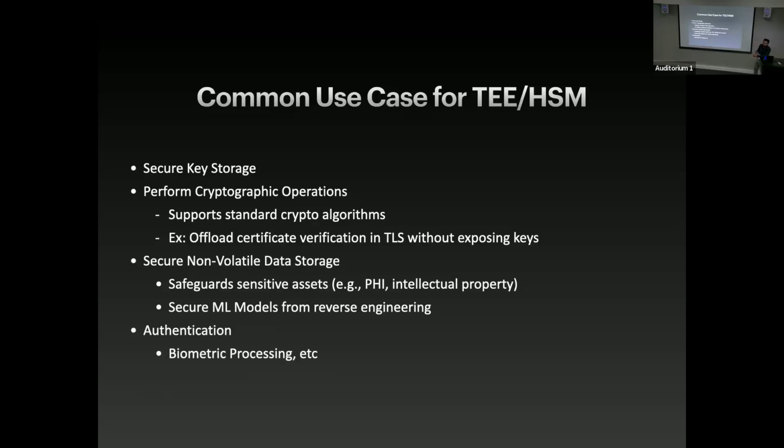So one of the use cases would be if your device is authenticated to any other third-party device or module, then you can do this TLS verification, right? So you can offload this TLS verification part to the TE. That way, you don't need to expose your private keys. So the application doesn't need to access your private keys to do the TLS verification, because it's all happening in the TE. So you are decoupling the sensitive verification part and putting that in the TE. So that's how you should design the system.